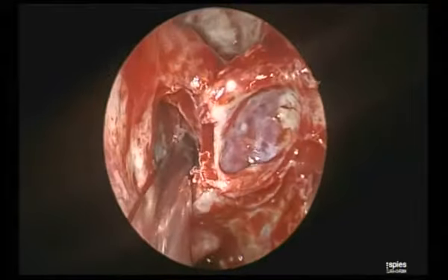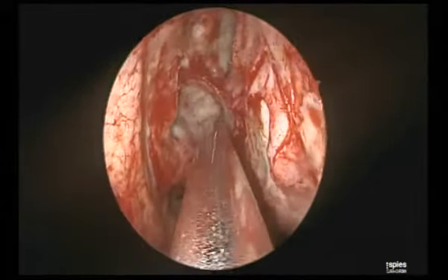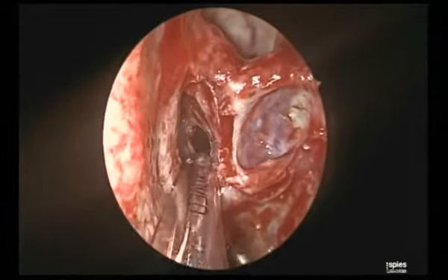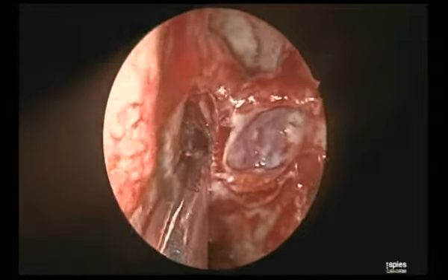Why I told you not to go above this? If you try to go above here, it will be in the skull base. This sphenoid ostium is not at the level of the floor of the sphenoid sinus, it is at a little higher level. It's always at a higher level.